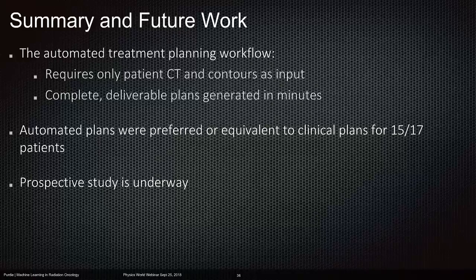I also want to add, I think one of the bigger advantages is we're doing effectively an optimization spatially without relying on things that were typically used for making plans, i.e. dose volume objectives from DVHs. So we don't rely on DVHs at all to be able to do this, and users don't have to specify any objectives at all. And so what we can hopefully do is better articulate how the dose is going to fall off within a target, or how things are spared, and there's no iterative approach.